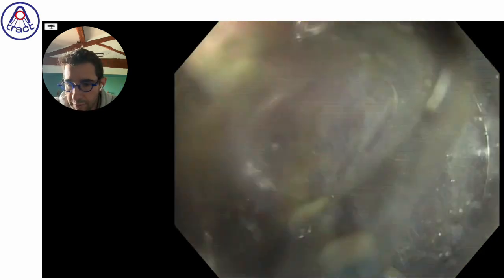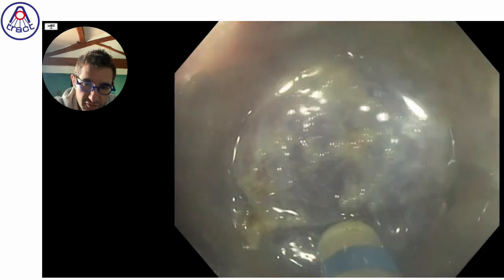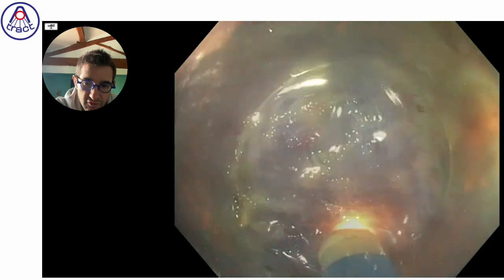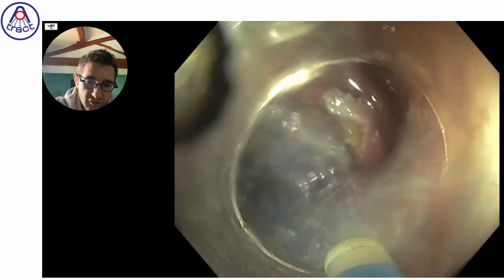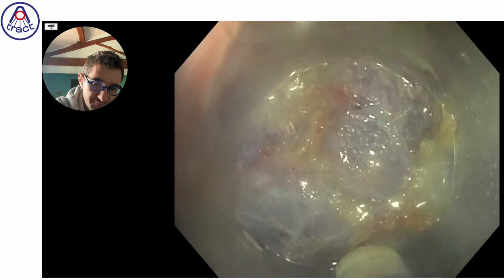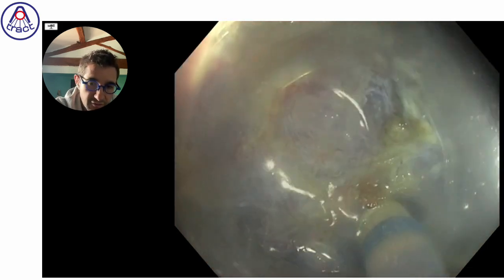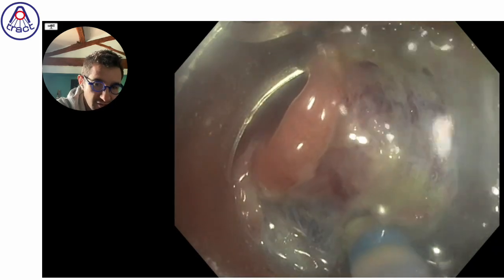In this case, with the pediatric conventional colonoscope, which is a little longer and stiffer for this kind of resection, unfortunately, the flushing function is going around 8 o'clock, although the device is at 6 o'clock. So when there is a relatively big bleeding, you are obliged to change the position of your scope to wash and therefore come back to coagulate, which is not so easy. But now, with the therapeutic colonoscope dedicated to ESD, it's really easier thanks to this water function that goes exactly in the axis of the device.